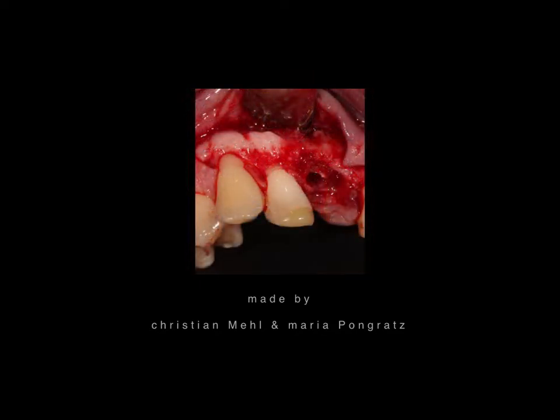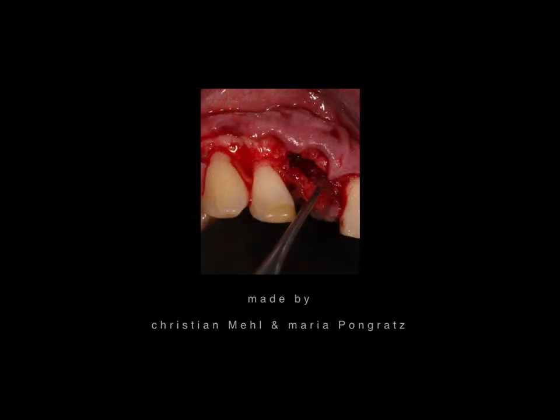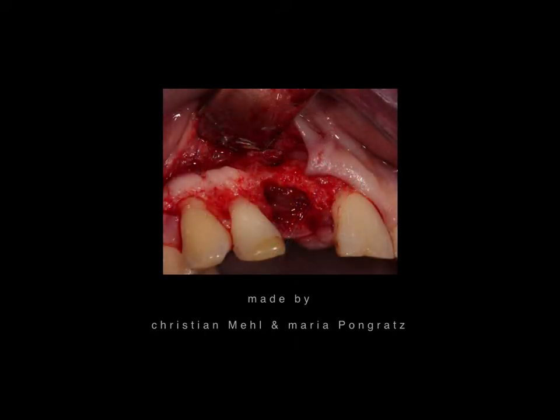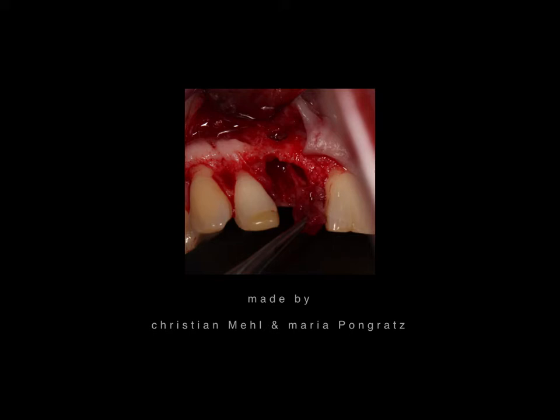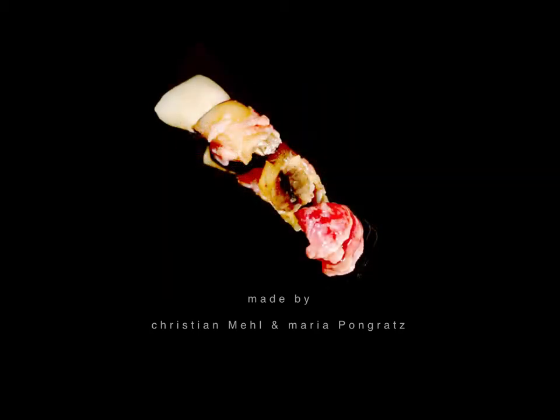Then we always split the tooth in half in mesiodistal direction, remove the tooth very carefully, not to destroy any of the buccal or surrounding bone. And here we can see the extent of the inflammation with the buccal fenestration, and of course then we have to really properly clean it. And here the situation is clean, so that we can prepare for the implant.